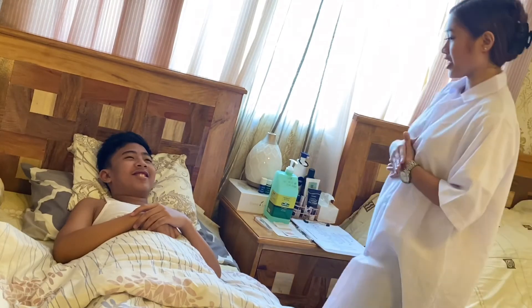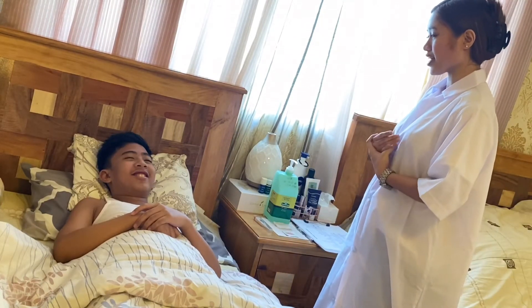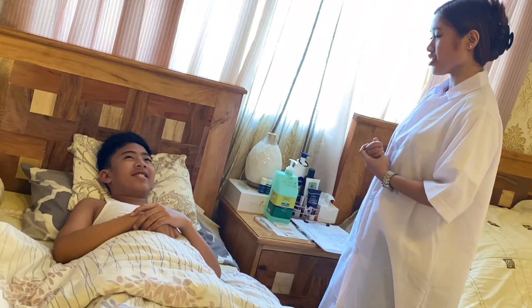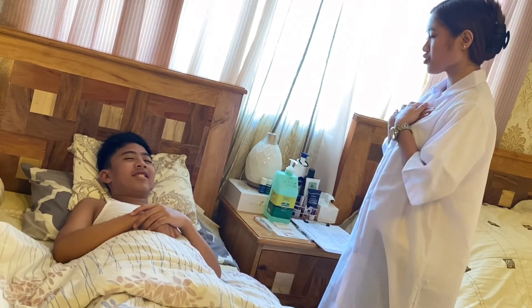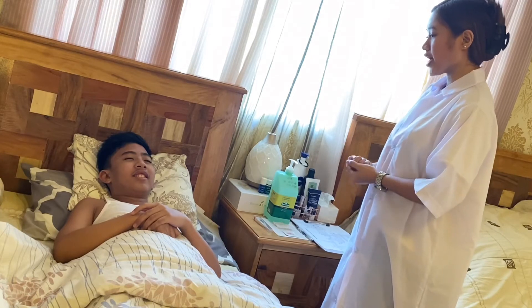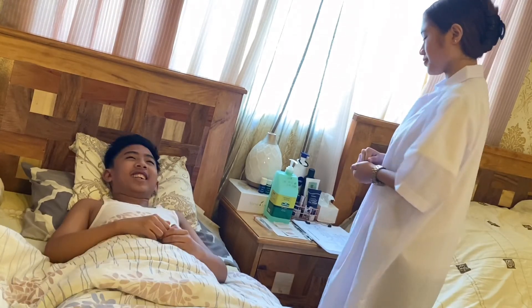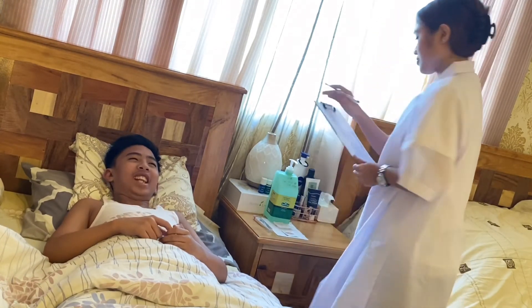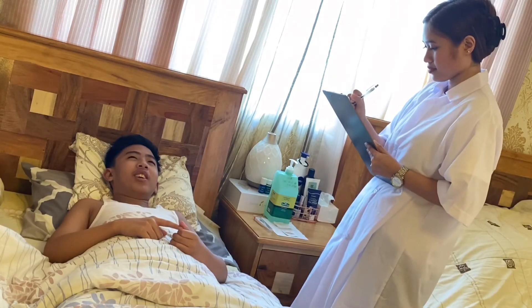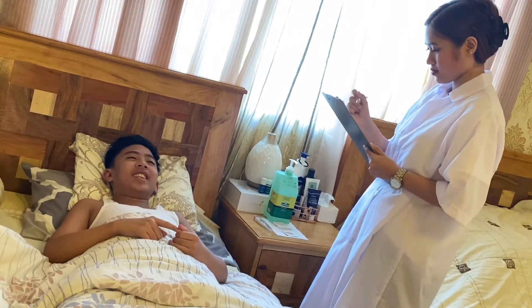Good day, sir. I am Julia Denise Gregorio from Nueva Ecija University of Science and Technology College of Nursing, and I will be your student nurse for today. May I know your name, age, and birthday, sir? The patient responds: Prince Carmelo, age 12, August 19, 2008.